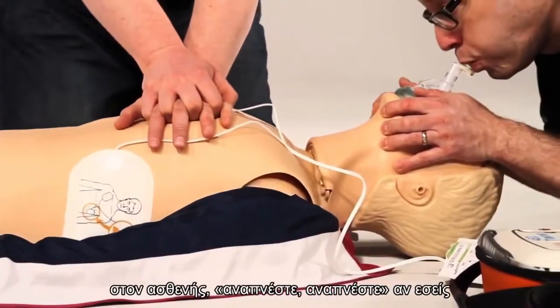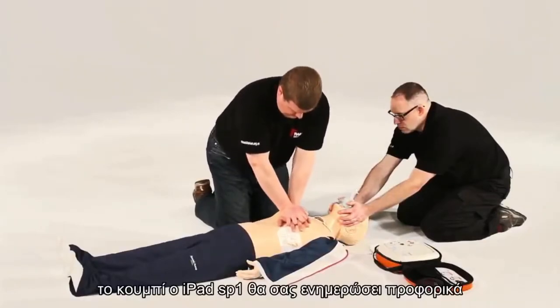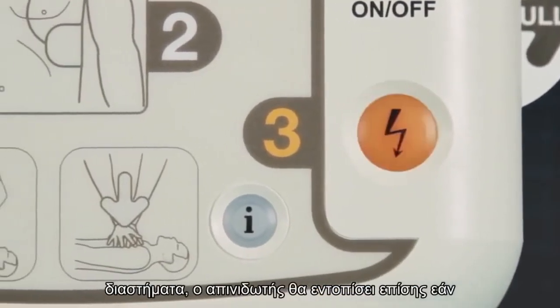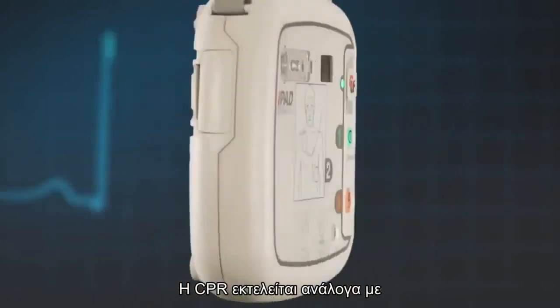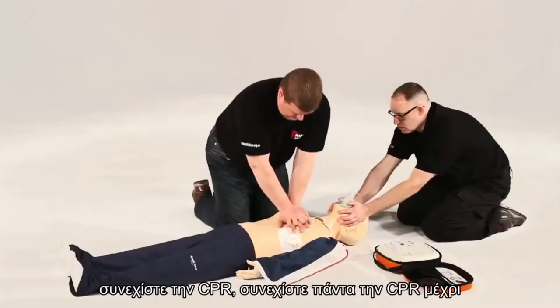CPR voice prompts include a metronome for compression rate and a verbal command for when to breathe for the patient. If you choose not to press the flashing blue I button, the iPad SP1 will verbally tell you how long until it reanalyses. This will be repeated at regular intervals. The AED will also detect if CPR is being performed and will instruct either to commence CPR or encourage you to continue CPR.